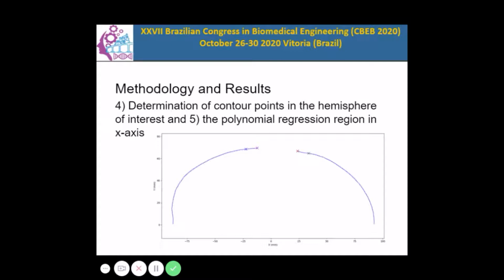The set of reference points included in the regression affects the morphology of the resulting curve. Therefore, it's important to define reasonable criteria for the region that provides such reference points. First, we set the initial and ending point of the bone defect by finding the largest interval between the X coordinates of subsequent points, which are the more central X's on the figure.